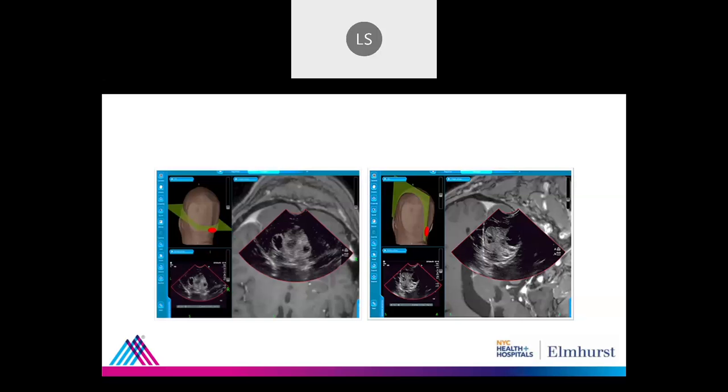We can create an axial and a sagittal view, but we cannot create a coronal view from this point, right? But with these two, we can kind of see most of the tumor and create a three-dimensional picture in our minds. There are some 3D ultrasounds that have been used in neurosurgery before, but there are not many of them. And there's also another modality, with contrast, but I haven't read about them, and I haven't seen an actual machine.